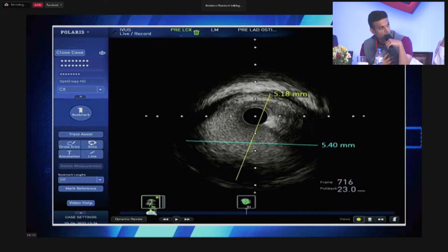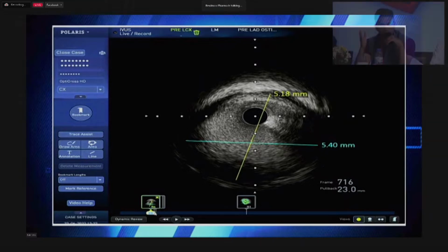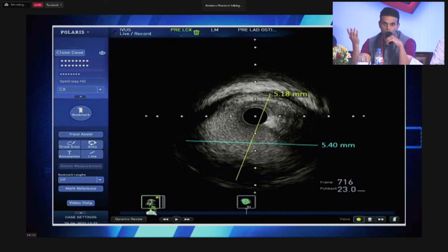For what it's worth, my practice is I actually do stent to the left main ostium where possible, because I find then that I can be as aggressive as I can be with post-dilatation in the left main. We know that your event rates are largely driven by minimal stent areas. And so if you can aggressively post-dilate in the left main, in this case to 5.2 or 5.3 or 5.4, which you may not want to do if you land your stent to the mid-vessel and stent EEL to EEL, you have to leave that last strut unpost-dilated, right? Then, you trade off your guide engagement for your next case against making sure that your left main is absolutely as large as possible.